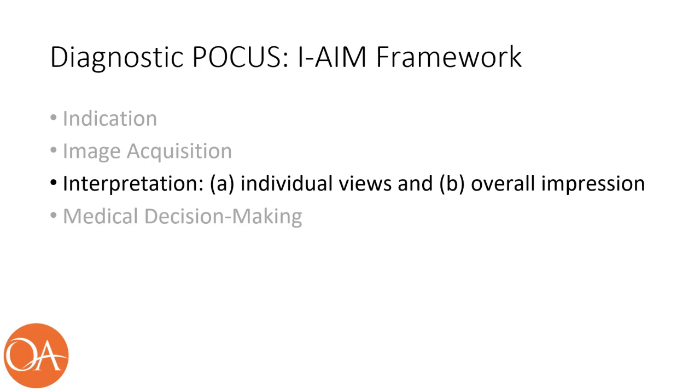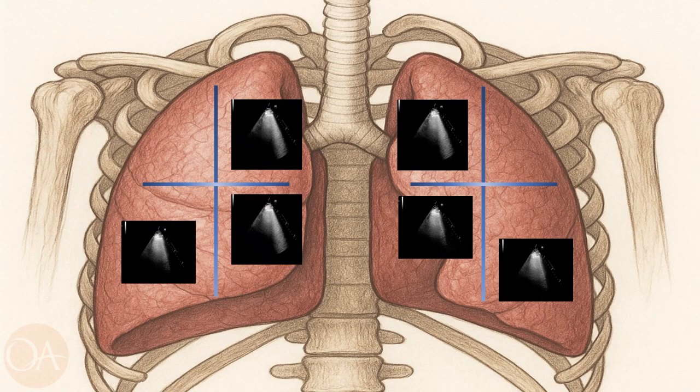Now let's return to our patient and review the sonographic findings and interrogate the available data to formulate a comprehensive clinical impression. On lung ultrasound examination, the patient demonstrates a bilateral B-line profile, with more than 3 discrete B-lines identified in each intercostal space across multiple lung zones on both the right and left sides. The diffuse distribution of B-lines is indicative of an underlying interstitial syndrome. When interpreted in an appropriate clinical context, such a pattern, particularly when symmetrically distributed, strongly supports the diagnosis of pulmonary edema, most commonly of cardiac origin.